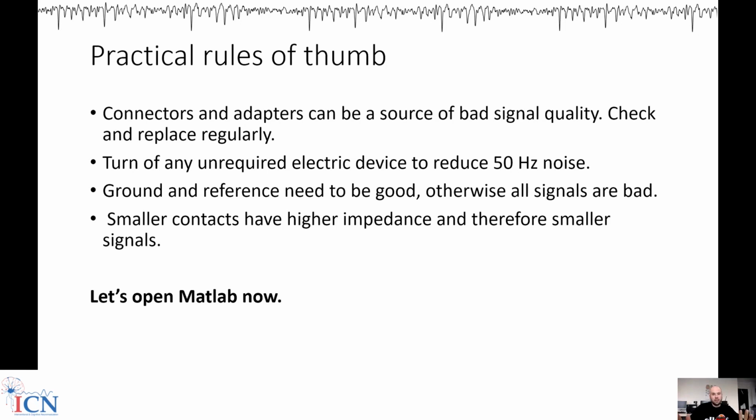If you have a device that is not battery powered, that's fine. I'm not even sure if the last version of ours is battery powered. It can be. But anyway, only keep plugged in the one thing that is required, and do not load, for example, your phone charger. If I see a phone charger in the wall, I would automatically plug it out before a patient comes into the room.